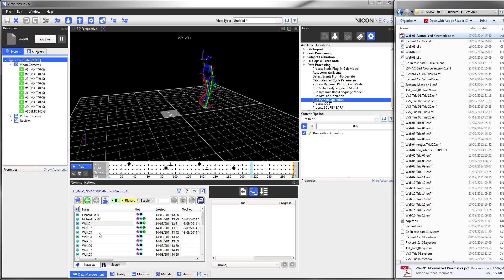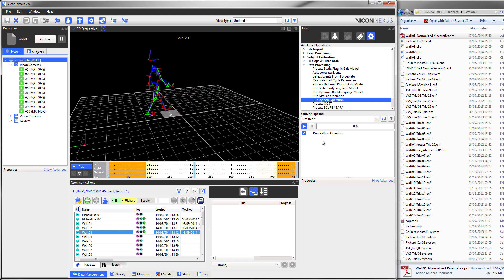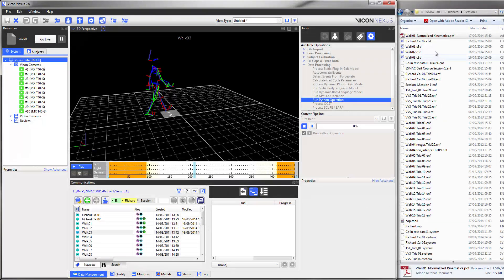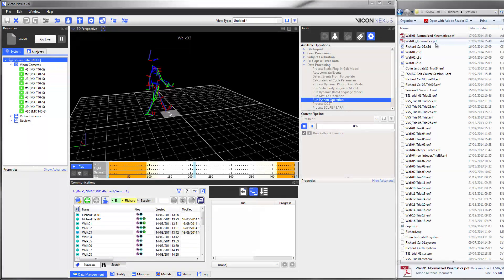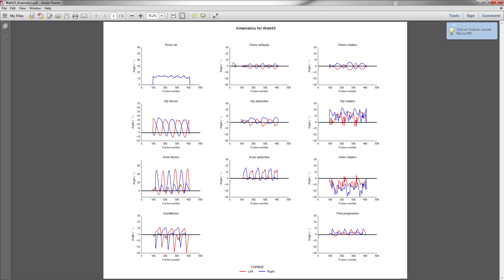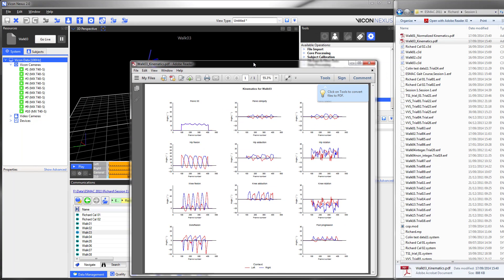This same script will work in trials without a gate cycle. Here we have a trial where we haven't assigned any gate cycles, and we run the script. We now get a new PDF file named 'walk03 kinematics', and there we have the plug-in gate kinematic model outputs for this specific trial.